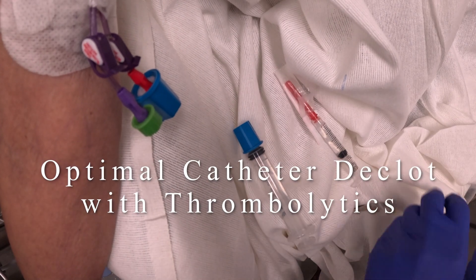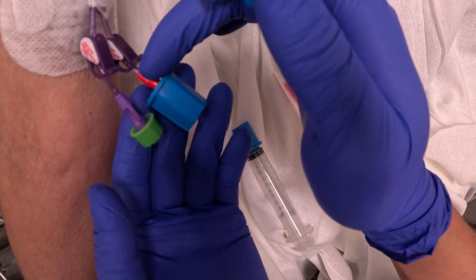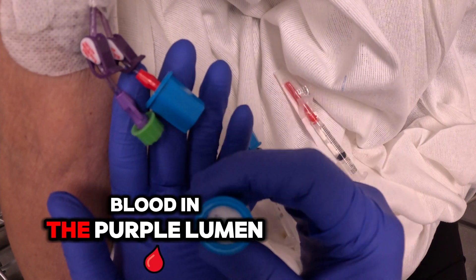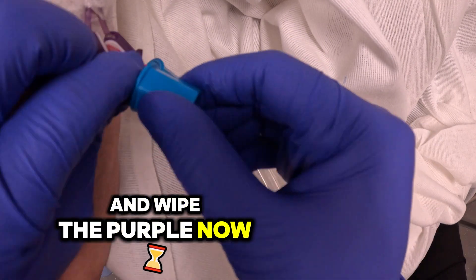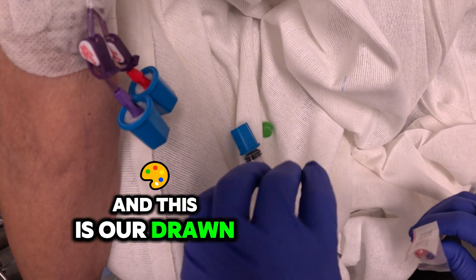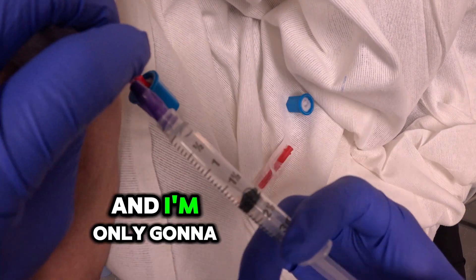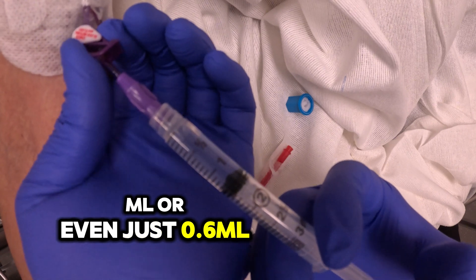We have a patient with a persistent fully occluded catheter lumen on the right with the red lumen, and a flush patent but difficult to draw blood in the purple lumen. I already wiped the red and I'm going to wipe the purple now, maintaining ANTT. This is our drawn up alteplase. I'm going to administer to the purple lumen that is patent first, putting in about 1 ml or even just 0.6 ml.